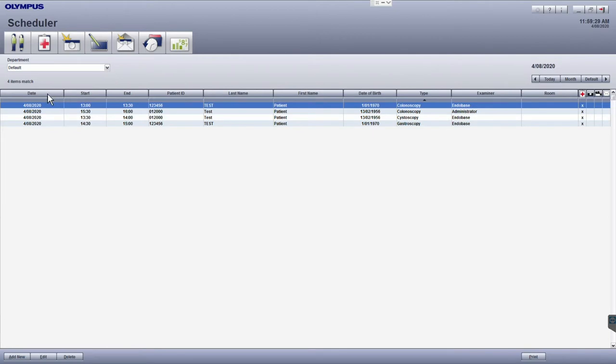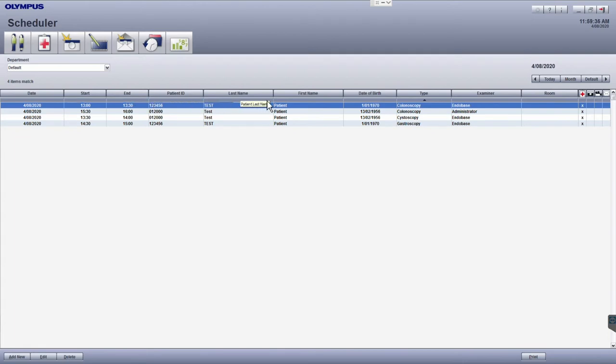Moving down we have our column headers which sort the information for your procedure or examination list. By clicking on a column header you will be able to set a filter for that column so the column header becomes highlighted in blue.